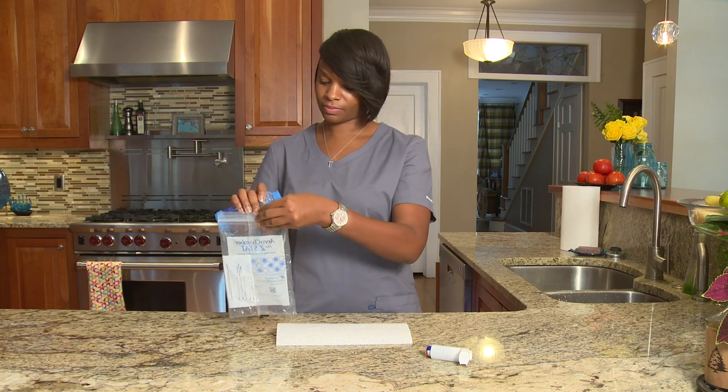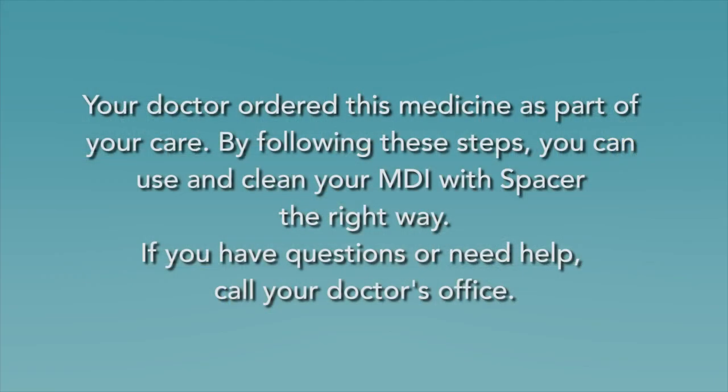Do not share your spacer with anyone else. Your doctor ordered this medicine as part of your care. By following these steps, you can use and clean your MDI with spacer the right way. If you have questions or need help, call your doctor's office.